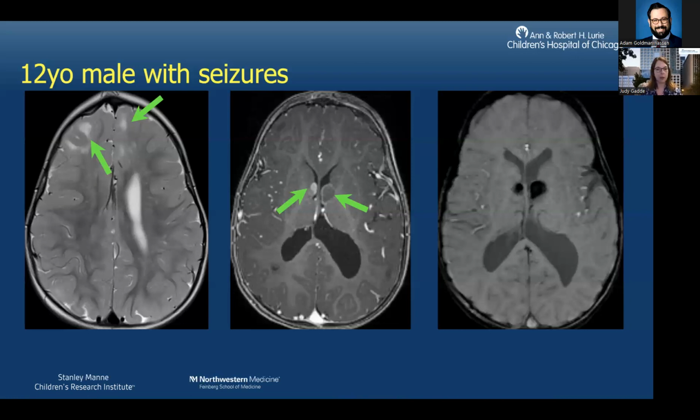In years past, they would have to do surgery to take those out, but now they will give them mTOR inhibitors, like I think it's everolimus, to decrease the size of those SEGAs to try to prevent having to do invasive surgery on these patients. So again, important to look at those subependymal nodules. Of course, look at the size of the ventricles to make sure that those are not slowly increasing over time, and make sure that they're not developing hydrocephalus.